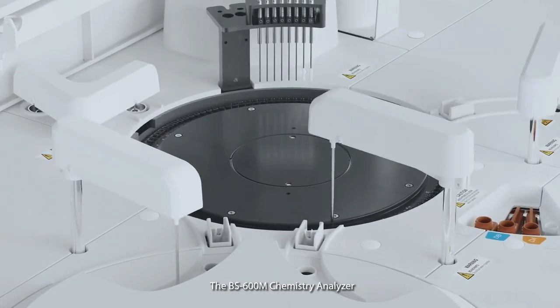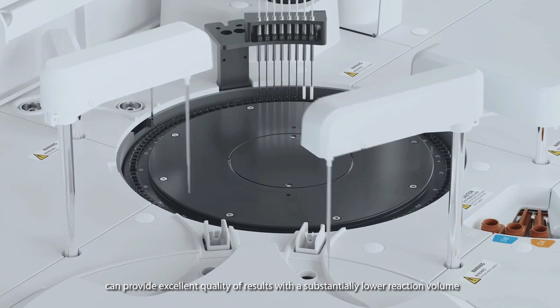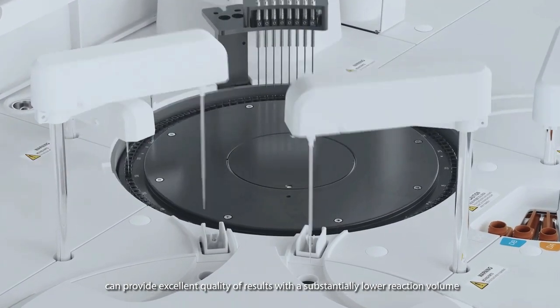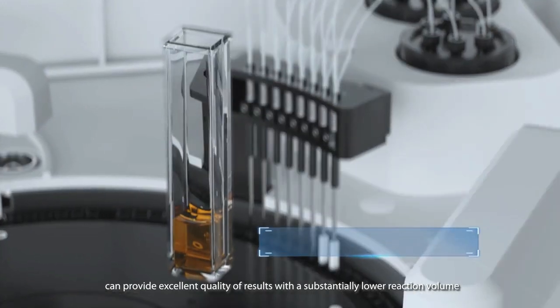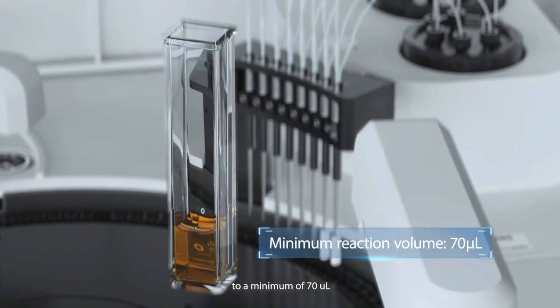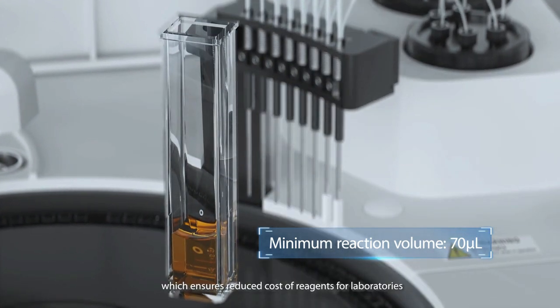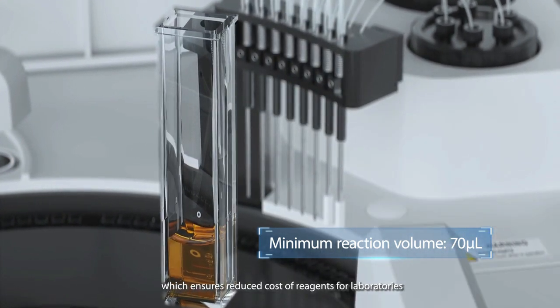The BS 600M chemistry analyzer can provide excellent quality of results with a substantially lower reaction volume to a minimum of 70 microliters, which ensures reduced costs of reagents for laboratories.